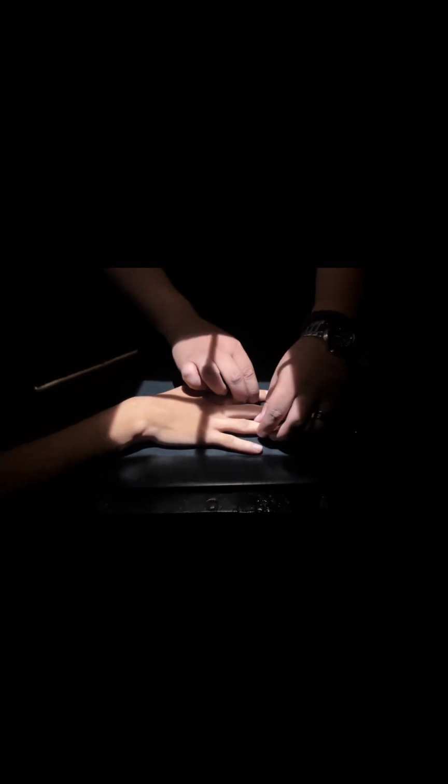So, part position. Palm flat on IR with fingers slightly separated. Long axis of hand and forearm aligned with long axis of IR. So, CR must be perpendicular to IR and directed to third MCP joint.